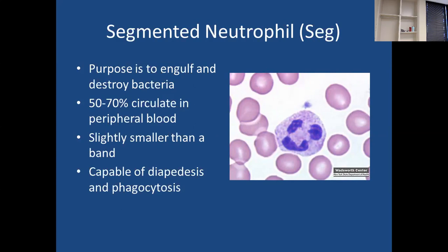You might see a myeloblast. You want to take a picture of that. Some people like to take pictures for study. I had one student ask, can I take a picture of this so I can look back and know that this was a myeloblast? So I'm totally okay with that again. Just take the gloves off, wash your hands before getting your phone out.